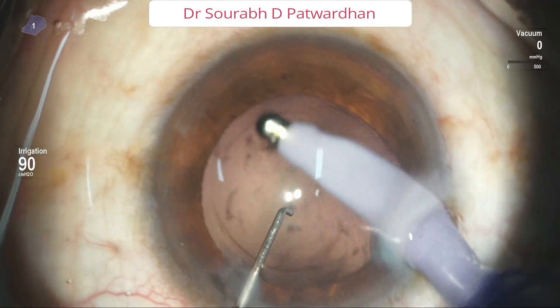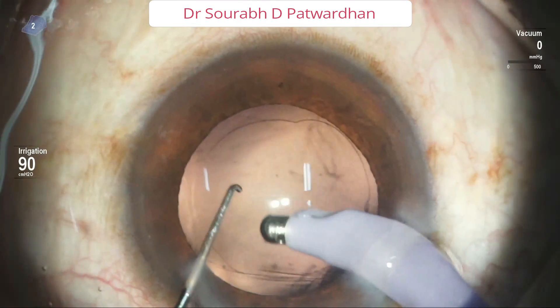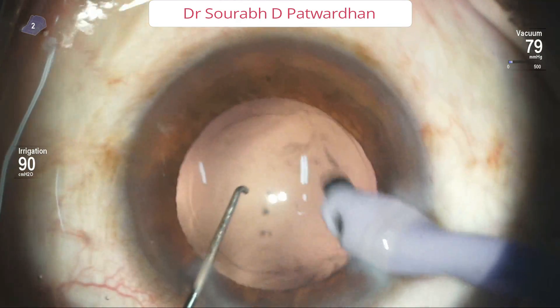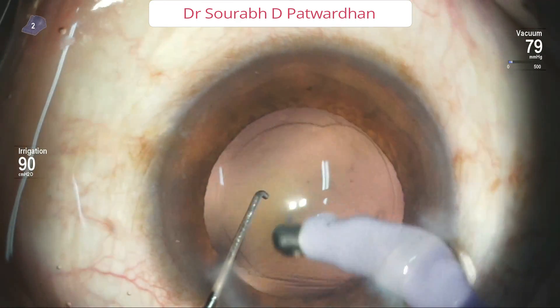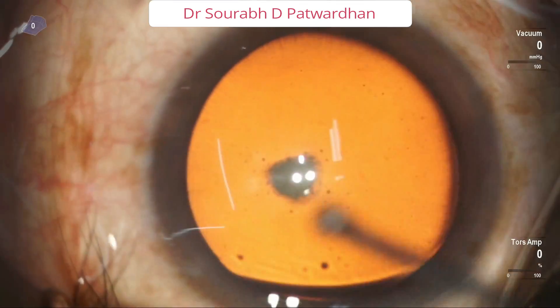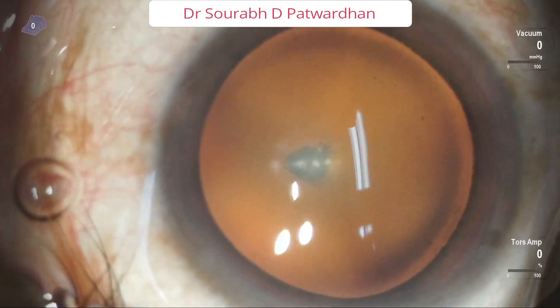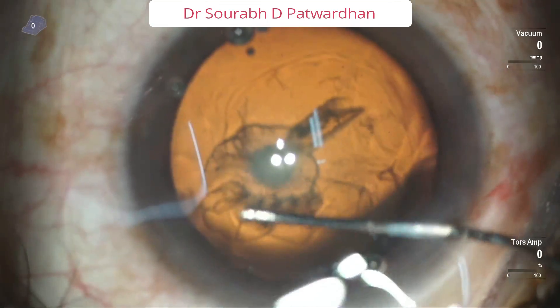The irrigation-aspiration of cortex is just as usual. The most important point is to aspirate at the edge of the nucleus, keeping in mind where the CCC margin is. Also, the vacuum should be used reasonably high.